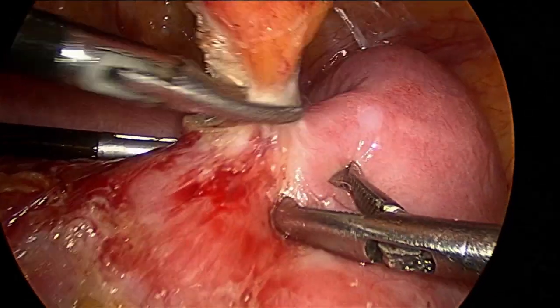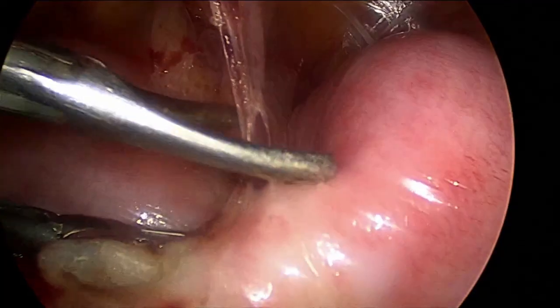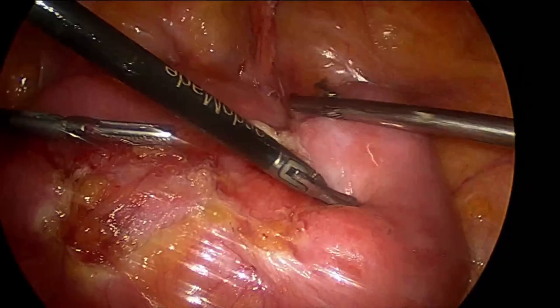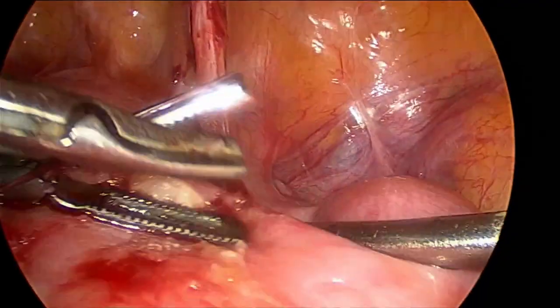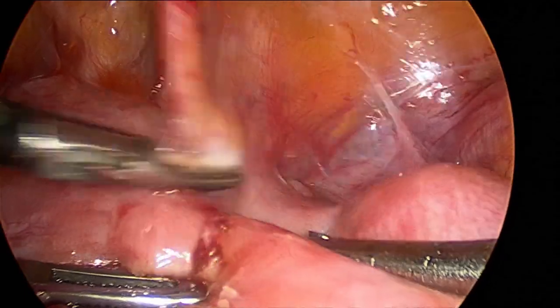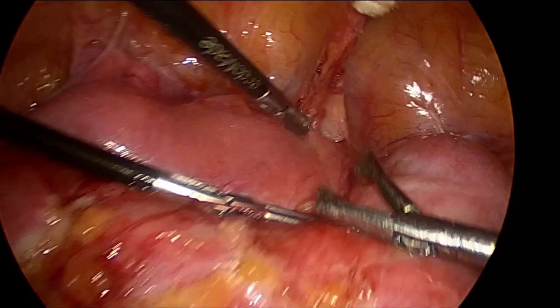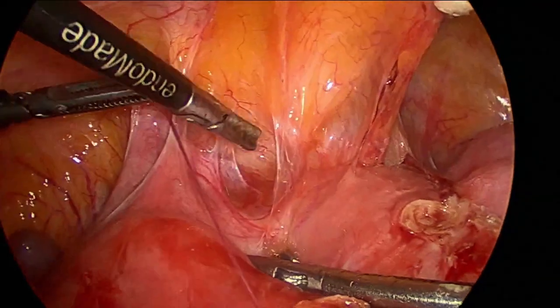After releasing this, the uterus is completely free from the anterior abdominal wall. We can then see the bladder adhesions, which are filmy as well as dense at the previous scar site.